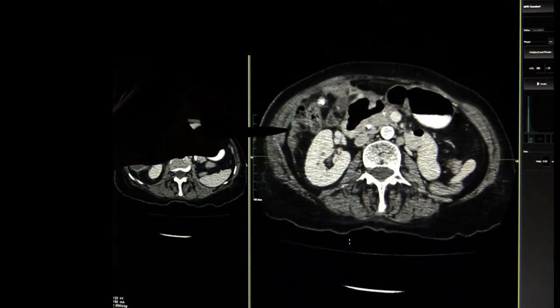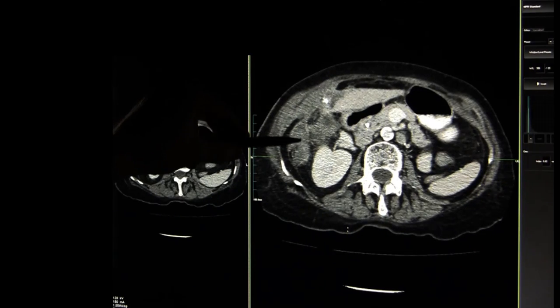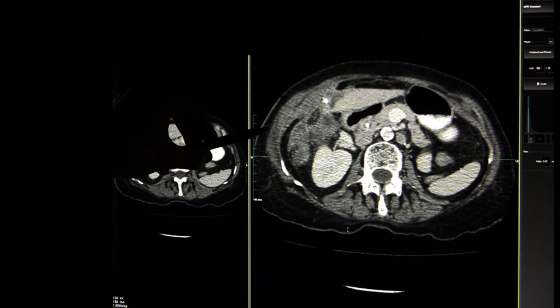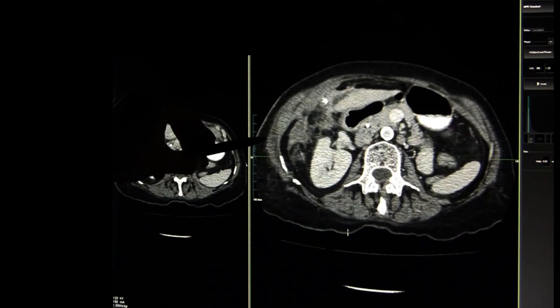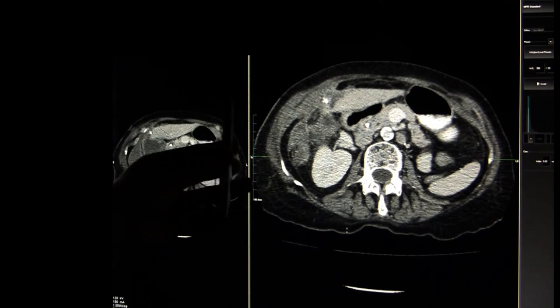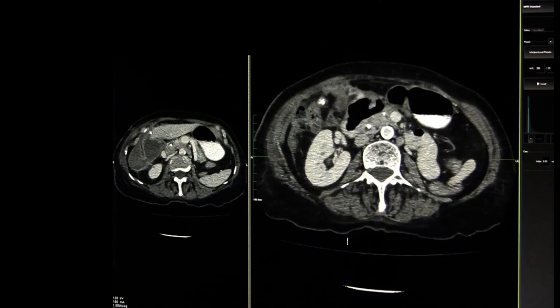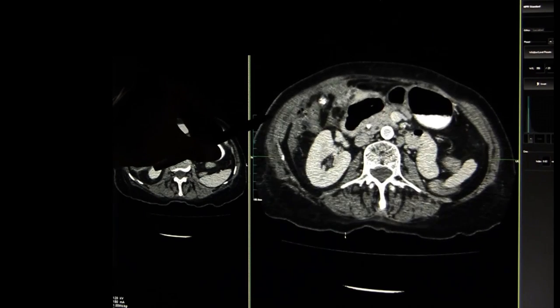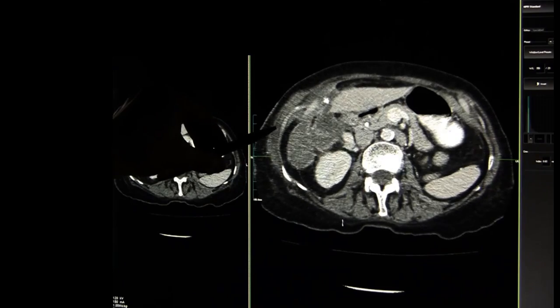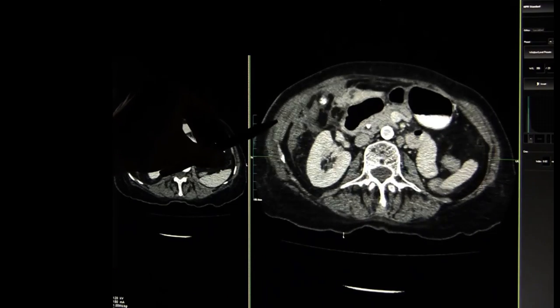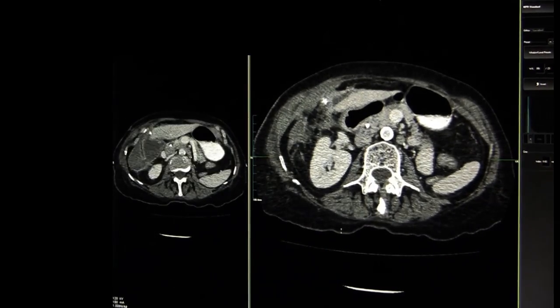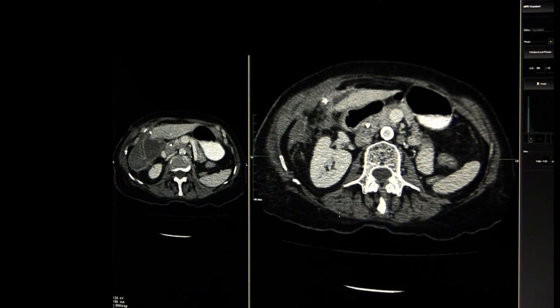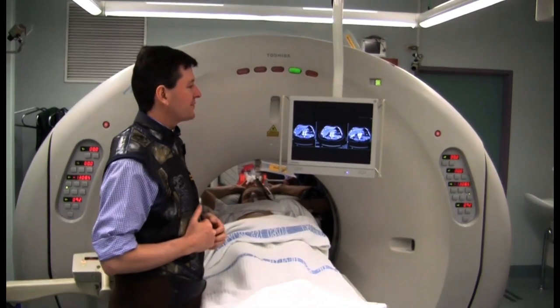As you can see, this collection starts to track down inferiorly. What we're going to demonstrate today is getting into the inferior-most part of that collection with a percutaneous drain. To do that, it'll be the same technique as you've seen before, where we're starting outside a plane of section. The actual point of entry in the skin is going to be down here somewhere. We'll then track the needle up through the skin, subcutaneous, and muscular layers and pop into this collection under direct vision — doing that real-time in fluoro. That's the plan.